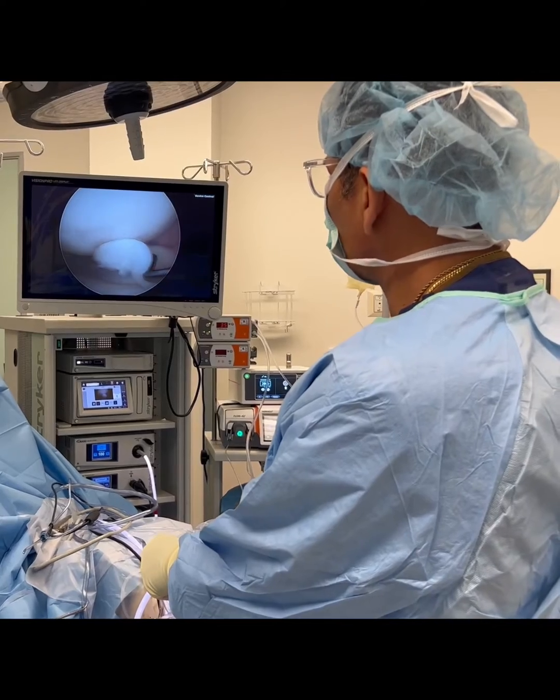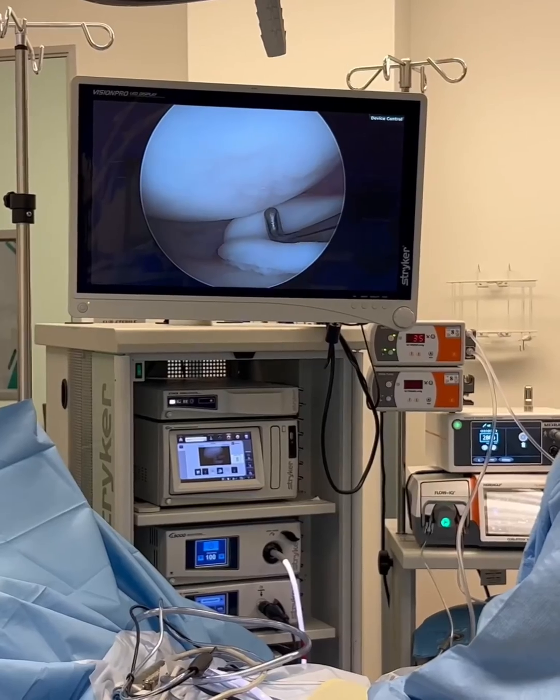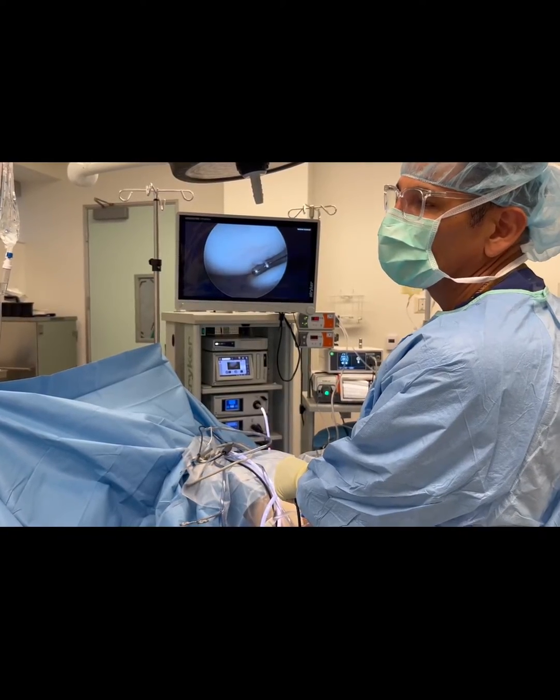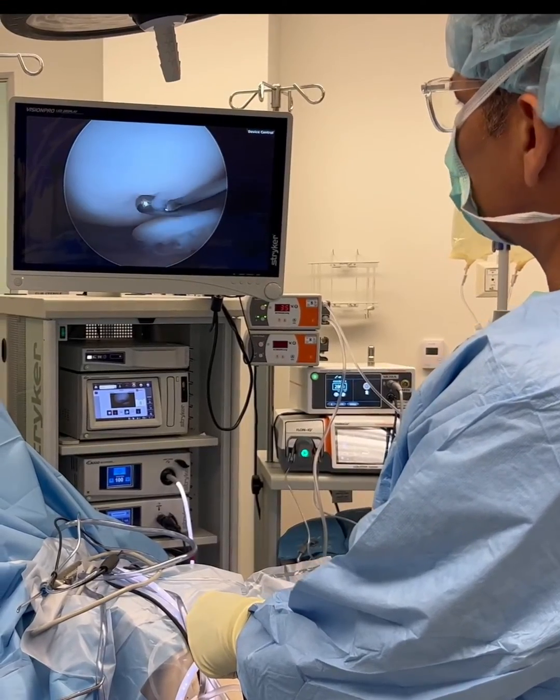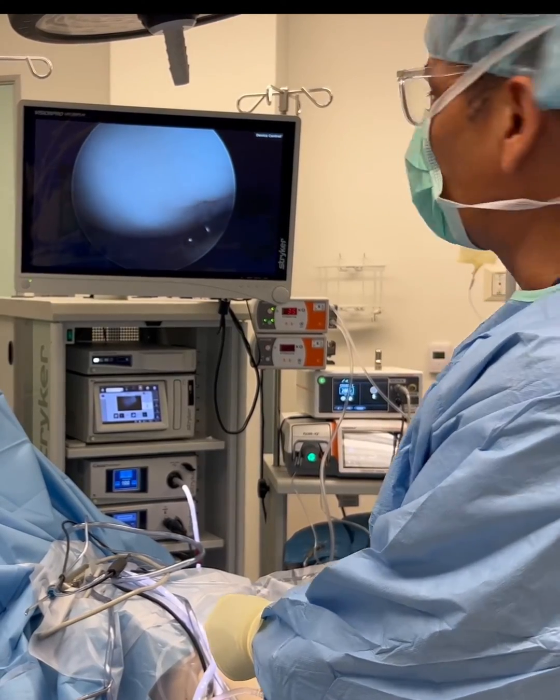So what I'm planning on doing is taking care of this meniscus tear. It's just going to be a little trimming right here, and the patient will no longer have the clicking and catching. That's what we're doing today — trimming of the little meniscus tear that was damaging the joint. You guys take care. Thank you.